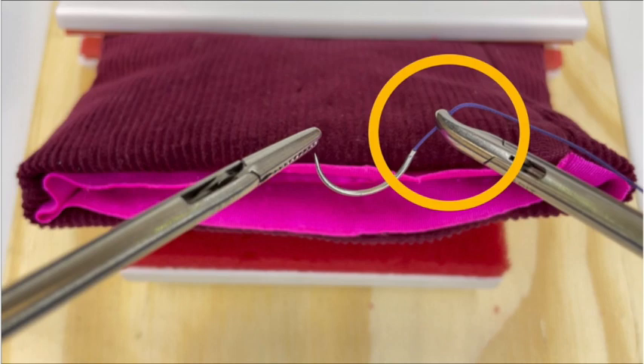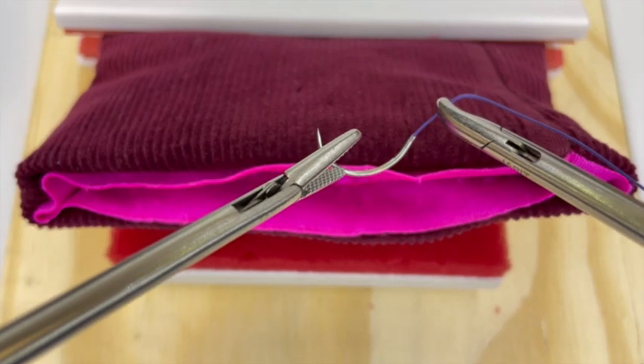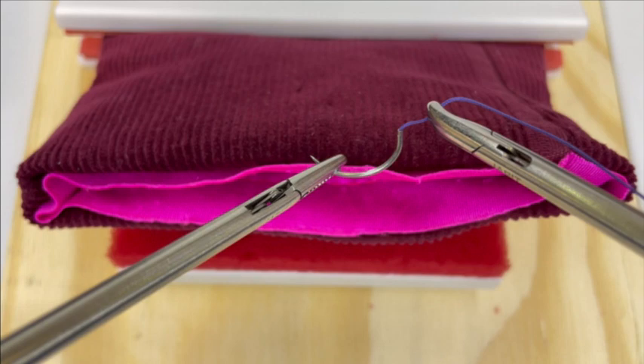The needle can be introduced via direct trocar entry or with a backloading technique, depending on the size of the needle and trocar. After insertion, grasp the needle with the non-dominant hand approximately one-third the distance from the needle tip. The needle can now be manipulated to alter the position.